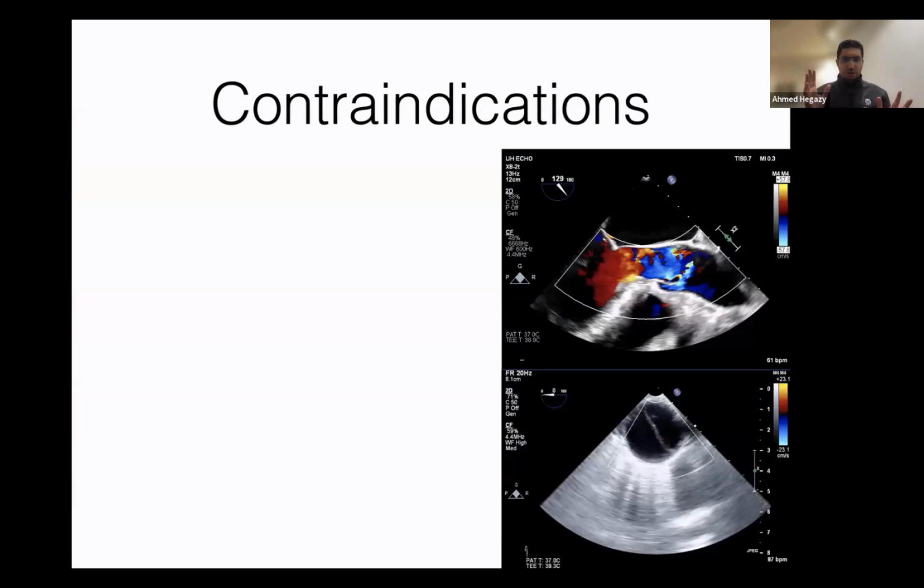Now memorize these criteria very well. Use them at the bedside. Go to the bedside. Put it on 1-to-1 initially and see if the augmentation of the diastolic pressure is higher than your systolic, and then put it 1 to 2. Look at the aortic end diastolic pressure, make sure it's lower than your native diastolic pressure, and then use the reference line to go and assess systole. You'll see the assisted systolic pressure will be lower than the native systolic pressure. So these are the 3 parameters. Let's move on to the contraindications.